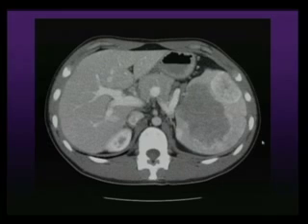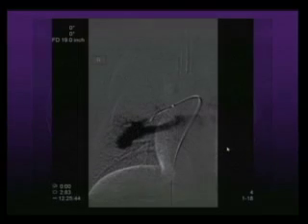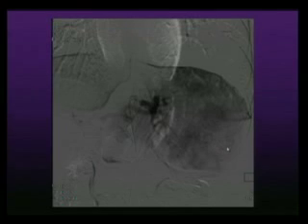This is his spleen. This is a hemangioma. See, a giant hemangioma, another one here. See the size of the spleen. Huge hemangioma. This is his pulmonary AVM. So we embolized the pulmonary AVM. Then we came in to embolize all the hemangioma. See, this doesn't look like a spleen. This looks like a tumor. It's all round. So we empirically embolized it. This is not to increase his platelets, but to prevent his spleen from rupturing, because there is a history of spontaneous rupture.